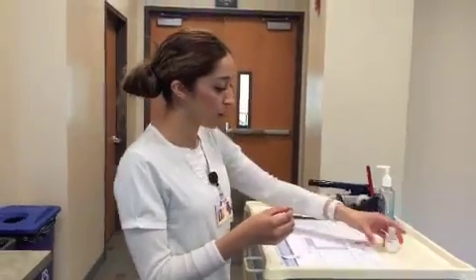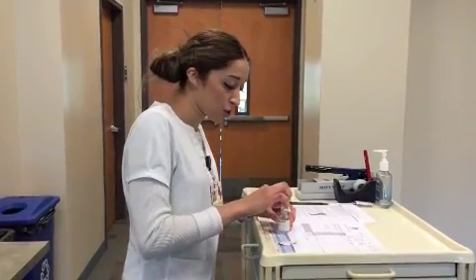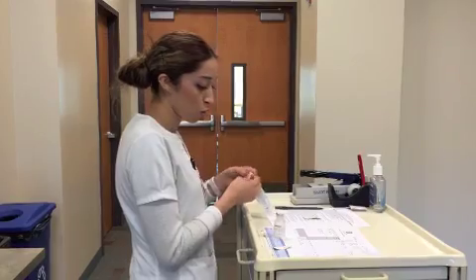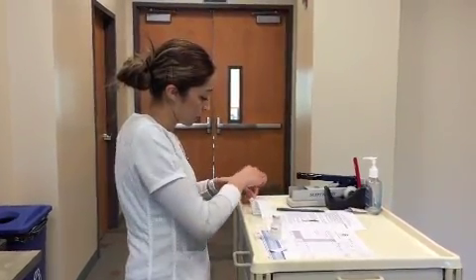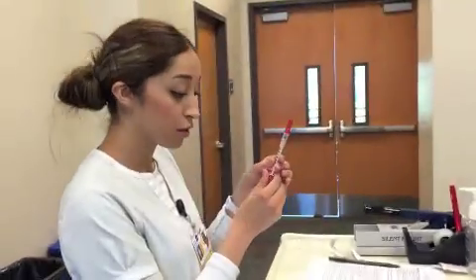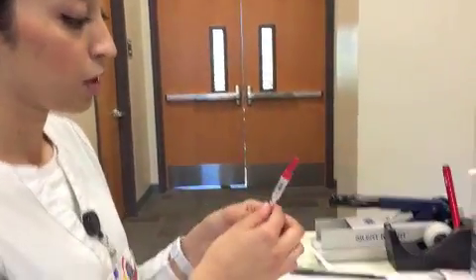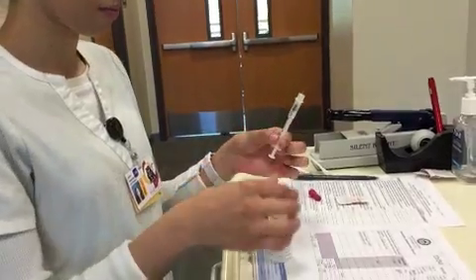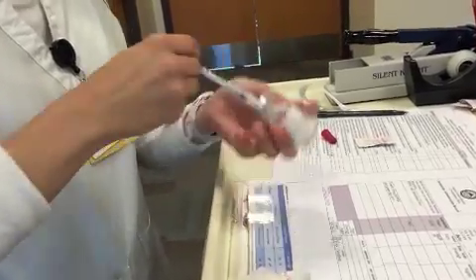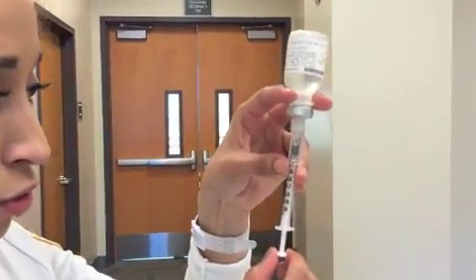So you get your alcohol pad. You want to wipe the vial from center outward. You can leave the alcohol pad on top. You open your syringe. You want to draw up the amount, so it's going to be 0.1. Go ahead, take this off. You push the air in, flip it over, and without touching the middle part, you draw up.